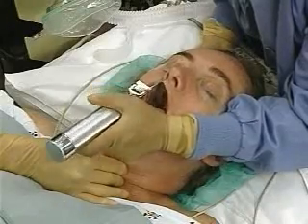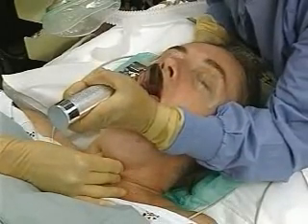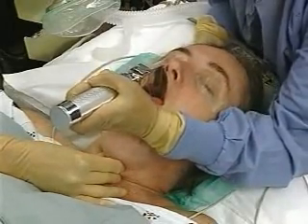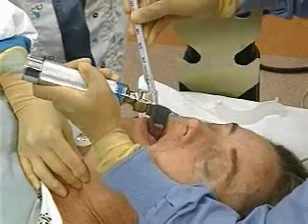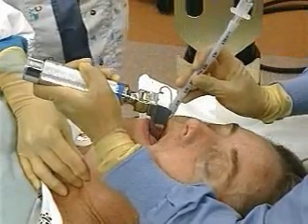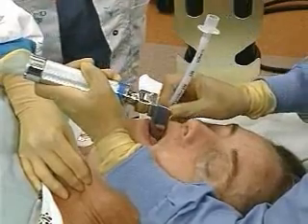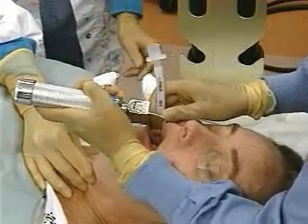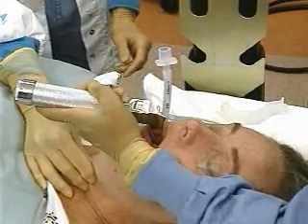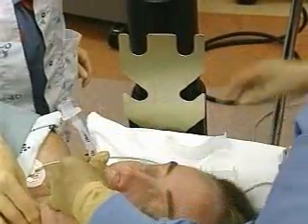Avoid cocking the left wrist backward and levering the blade on the teeth. Lift the laryngoscope handle straight up until the vocal cords are visualized. Pass the styleted tube with the cuff deflated into the right side of the mouth and through the vocal cords. Remove the stylet as the cuff passes through the vocal cords, then place the endotracheal tube so the cuff is just distal to the cords and cannot be seen between or above the cords. Inflate the balloon with 5 to 10 milliliters of air and hold the tube firmly in place at the lips.